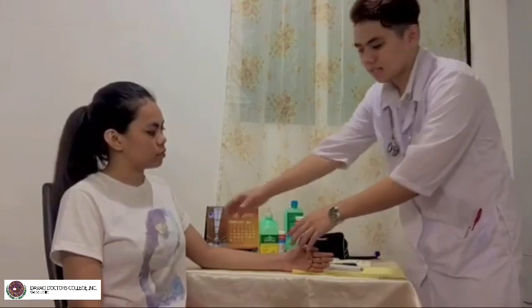So since my client is sitting, we need to bend the client's elbow to a 90 degrees angle as you can see, and then support the lower arm on the chair's arm rest, and then extend and flex the wrist with the palm of the hand facing downward or inward.